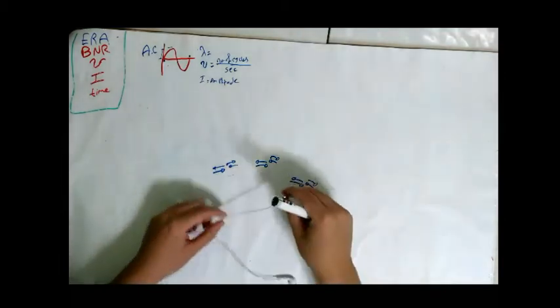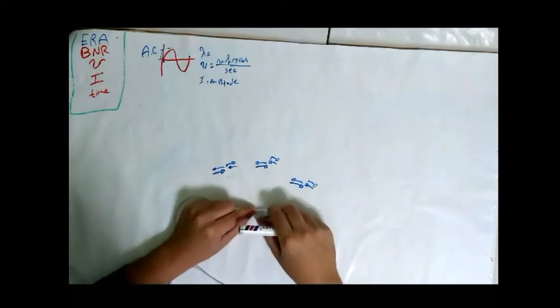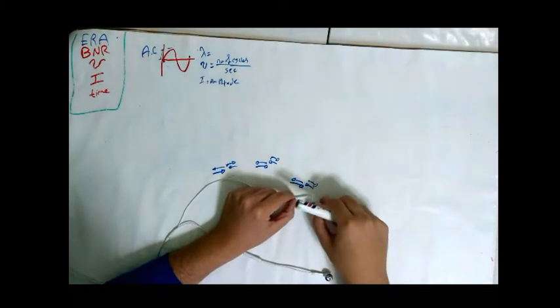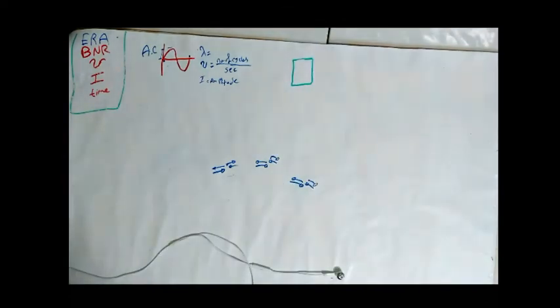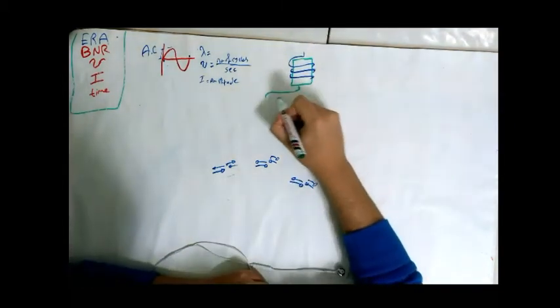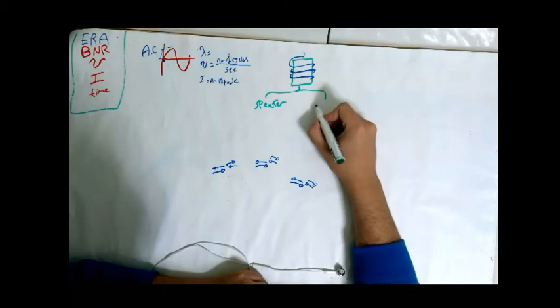Finally, at the end of the wire, there is a transducer head or the earpiece in headphones. Inside this transducer head or earpiece, the wire forms a coil around a material. So this is going to be a material, and the wire is forming a coil around it. In earpieces, this material is a speaker, while in ultrasound, this material is a crystal.